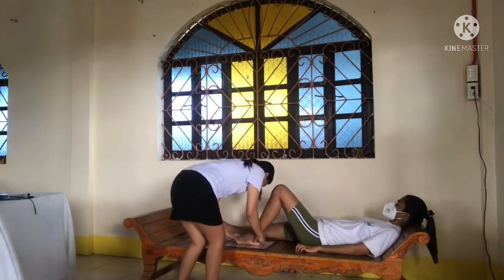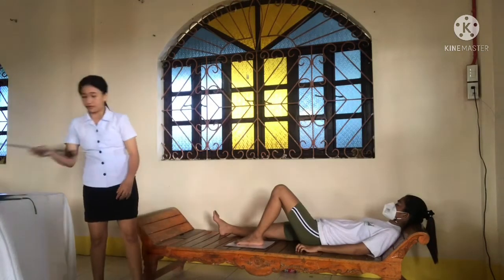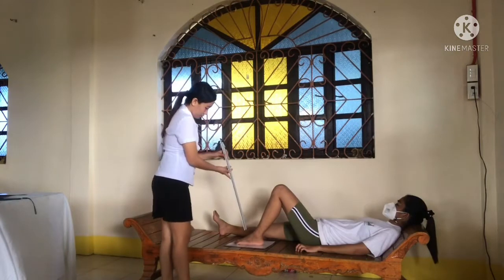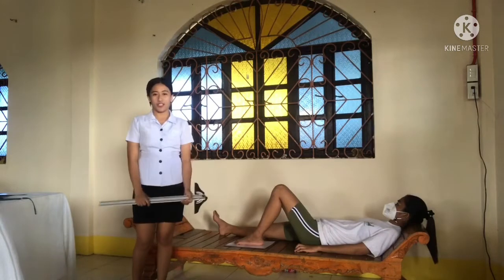And adjust it so that it is parallel with the foot and ensure that there is no rotation. So, angulate the central ray 10 degrees toward the heel to the base of the third metatarsal. So, this shows an AP projection of the tarsals anterior to the talus, metatarsal, and phalanges.